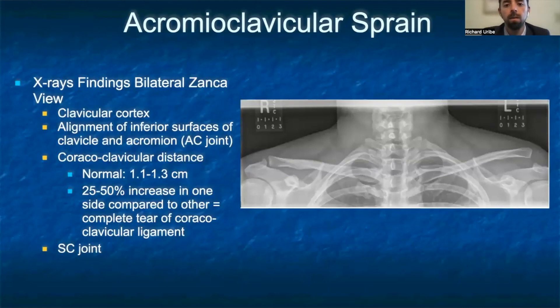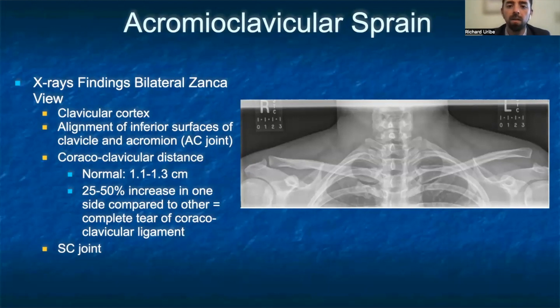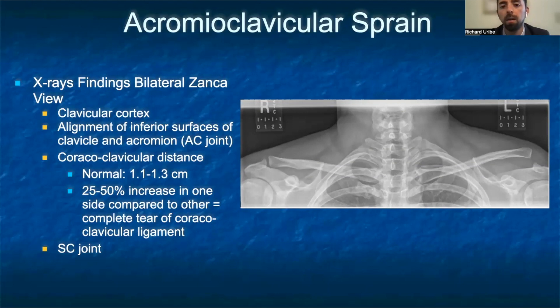The best x-ray view to examine AC joint injuries is the bilateral Zanca view. On the x-ray to the right, you can see an intact clavicular cortex. The coracoclavicular distance on the left is increased, and given that the increase is more than 25 to 50% compared to the right, there is strong evidence of a complete tear of the coracoclavicular ligament.